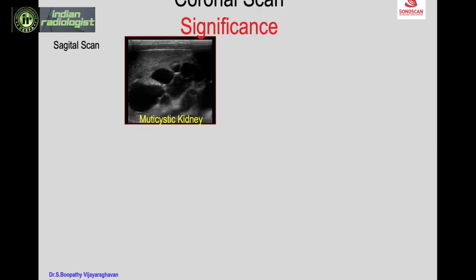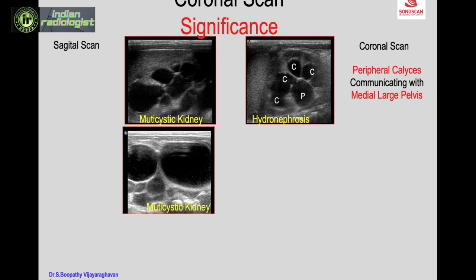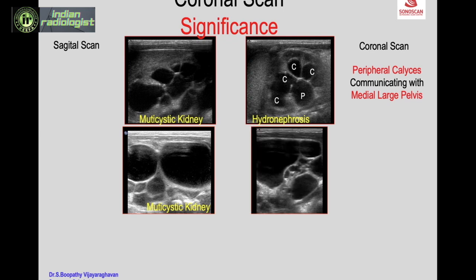The significance of certain diagnoses is section-specific — they will be seen only in a particular section. Here we see how the coronal scan is significant. In a sagittal scan you may see multiple cysts in the kidney, mimicking a multicystic kidney. But when you do a coronal scan, you see the typical appearance of hydronephrosis: peripheral dilated calyces communicating with the more dilated, medially placed large renal pelvis. Another example shows multiple non-communicating cysts of varying size — typical of multicystic kidney — confirmed on coronal scan.